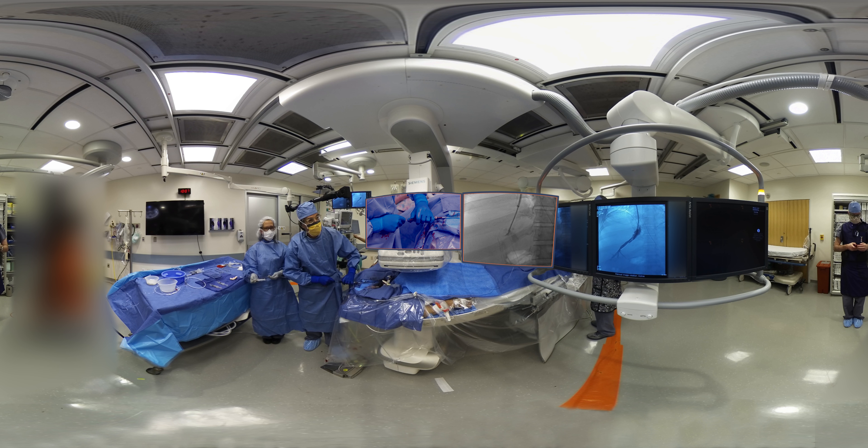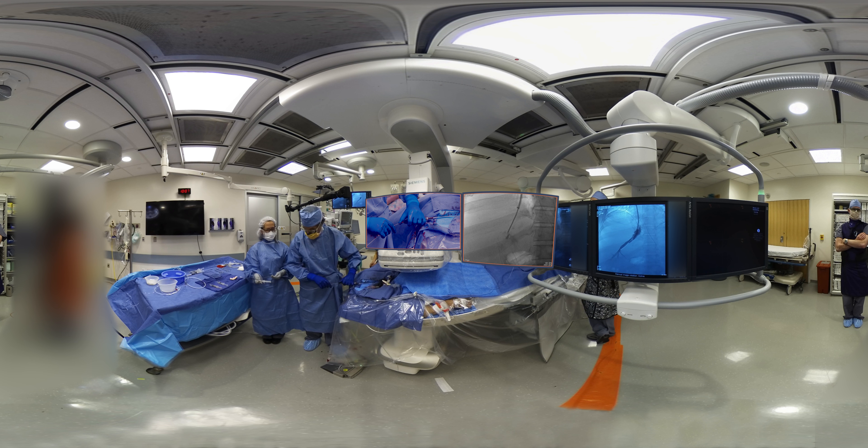What I have been doing is rotating the needle slightly and moving it back on the off chance that I was just about to enter a portal vein branch on the way back. That's not the case, even though there was a little bit of blood return. But honestly, if you don't try those types of entries, you miss opportunities. So I'm going to ask you to remove the guide wire completely, and I'll take that syringe of contrast.